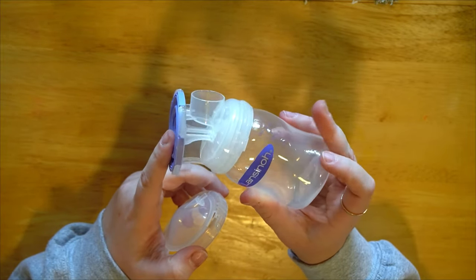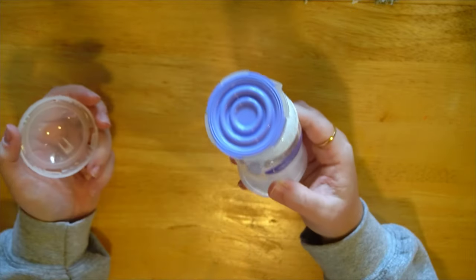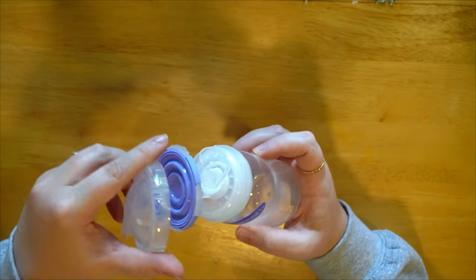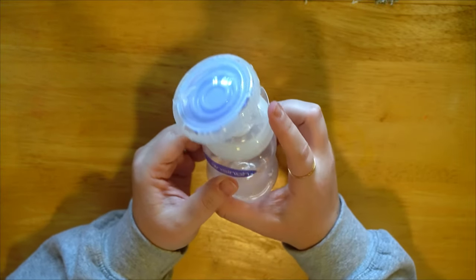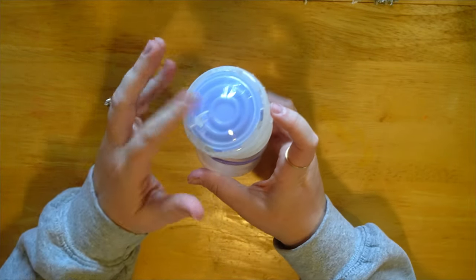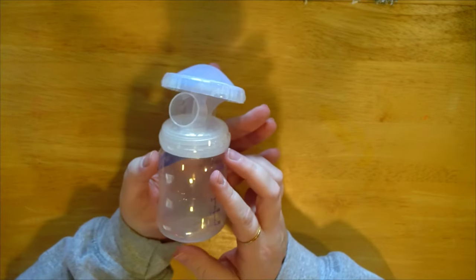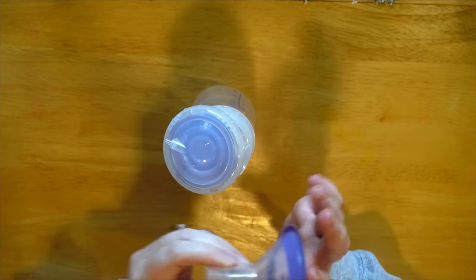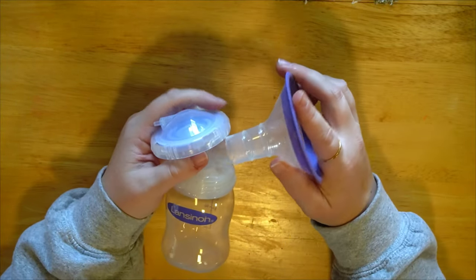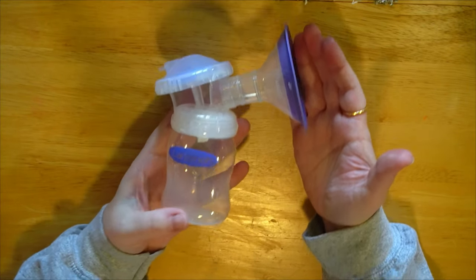Then put the lid on — put it a little off-center at first, then twist it so it's more straight on. Use whatever flange you have and put that right on, and there you go — pump parts assembled and ready to go.